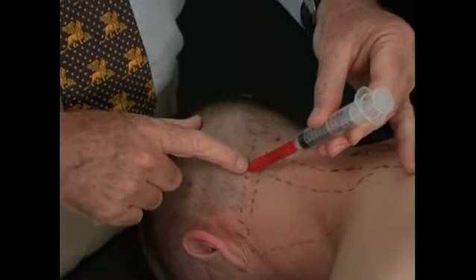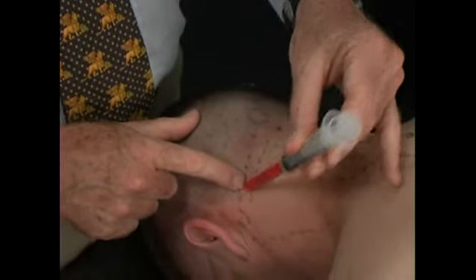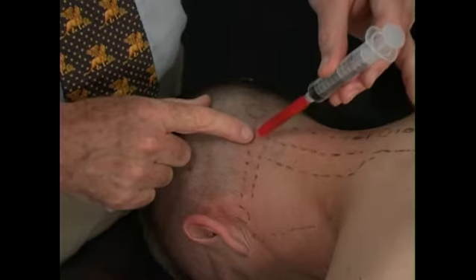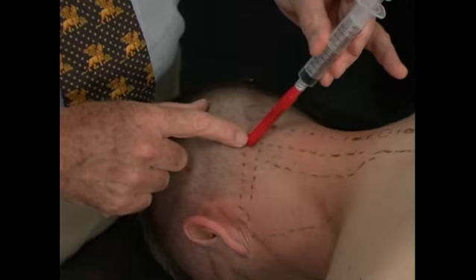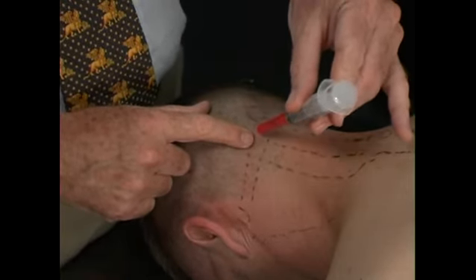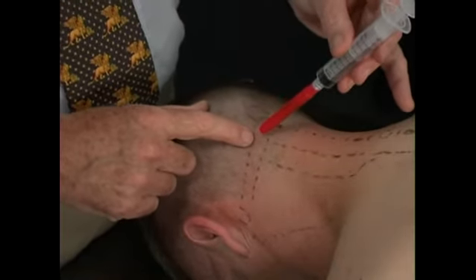We would then carry our injections out right along the nuchal ridge, either doing individual injections or doing needle withdrawal to the skin line and then redirecting our needle about 15 degrees, going back into the nuchal ridge, coming back out to the skin line, redirecting our needle medially and going back into the nuchal ridge.